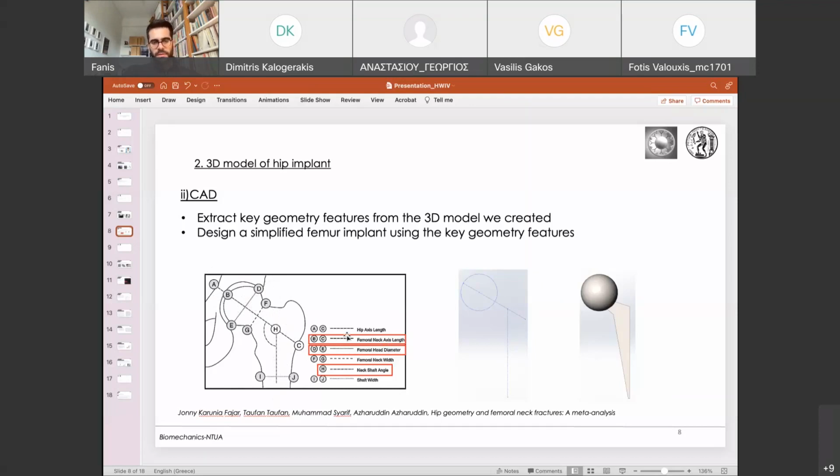So taking these three essentially dimensions, we can just create a very simple sketch. You can see it here. It's not a big deal, okay? And starting to build from that sketch and steadily adding dimensions and stuff like that, we can create a very simple 3D model that will allow us to study the problem and see problematic areas or some insights to better understand it. So those are the dimensions you will need to measure.